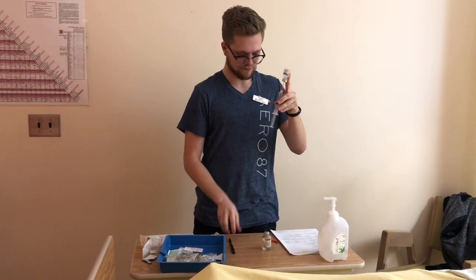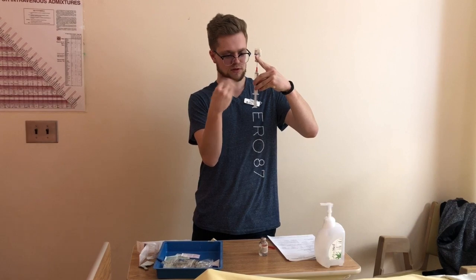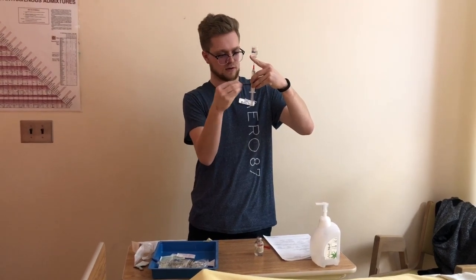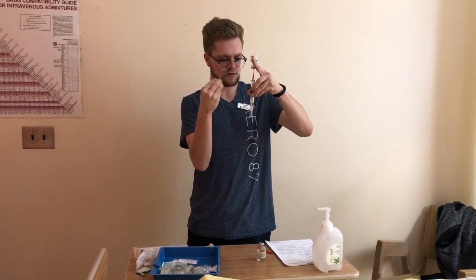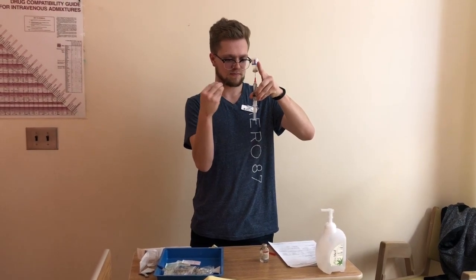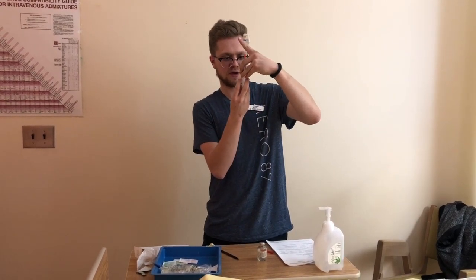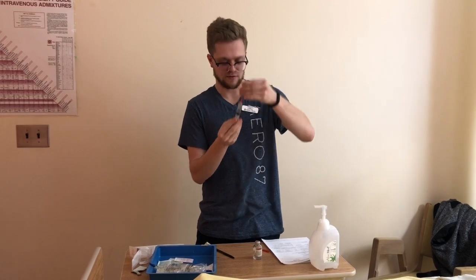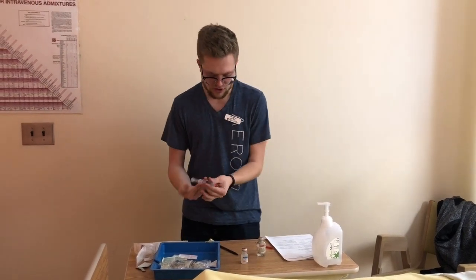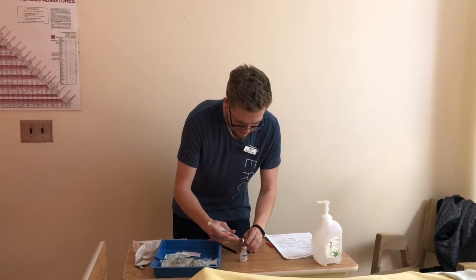Oh, cap went flying there. There we go. Okay. Make sure you got the right amount. Perfect. All right. So take that out. And then we'll be injecting it into our cloxacillin vial here.